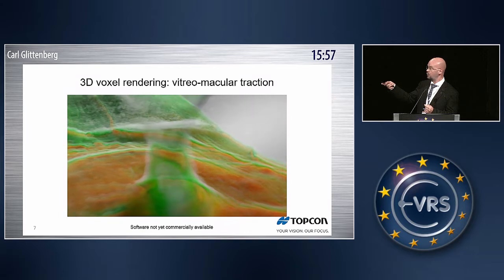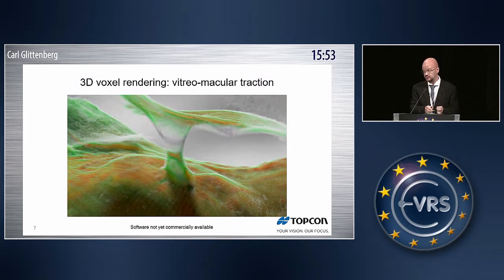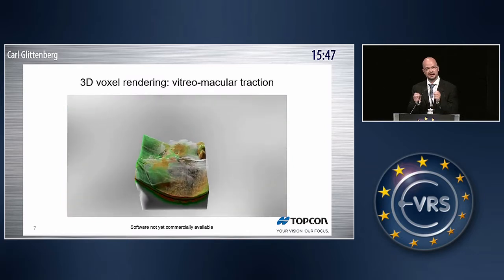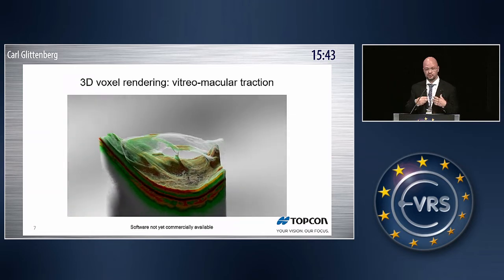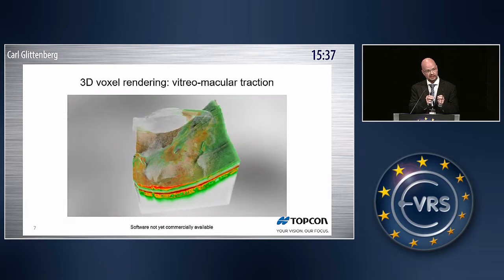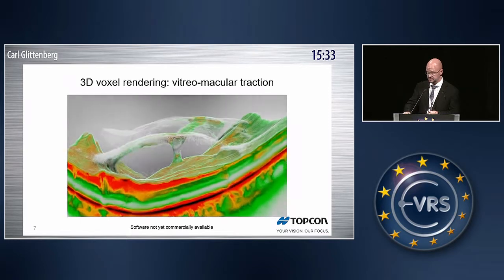Theoretically, this correlates to the density of the collagen fibers. So in this kind of situation, you could look at this visualization and glean information about whether this patient would be receptive to treatment with ocriplasmin, because you have a very small adhesive area and not a very dense adhesion.